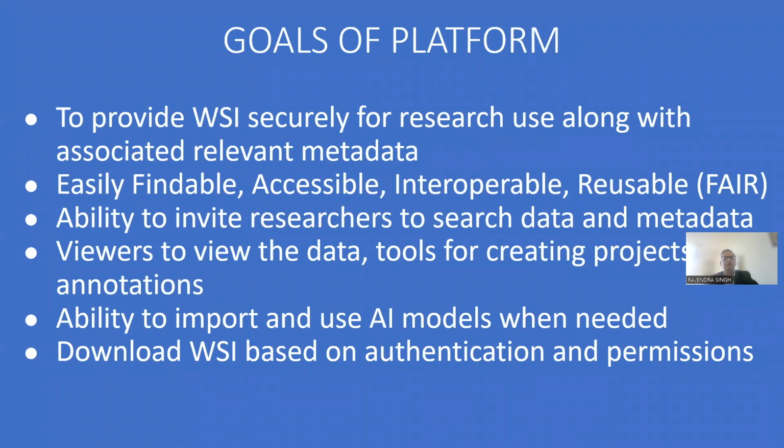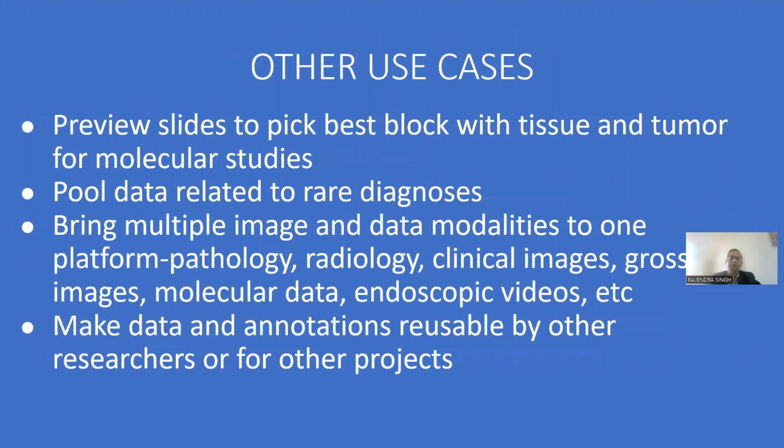The admins of the platform have the ability to invite researchers to search the data along with any kind of metadata that is associated with the whole slide images. It also provides viewers to view the data, and tools for creating projects and annotations. The researchers have the ability to import and use any AI module that they would like to use for the research. And based on authentication and permission, they would be able to download the slides if needed.